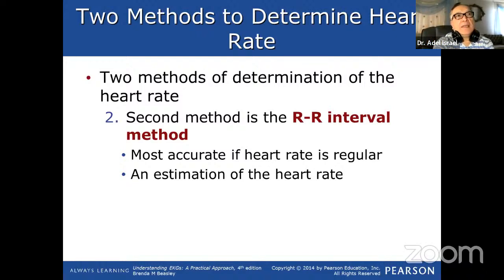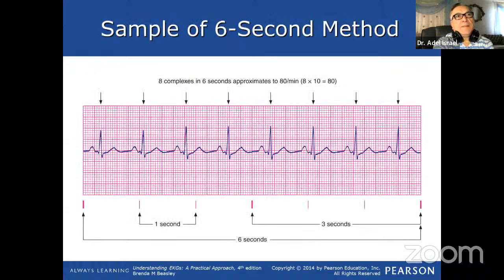If I go back to let you know about this issue, pay attention, please. Here I am in the back of these slides. The second method says that I am going to count how many big squares. Let us have this one, for example. So here is one big square, two big squares, three big squares, and almost four big squares.